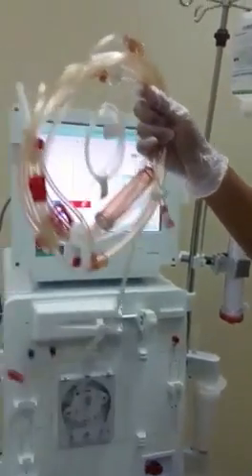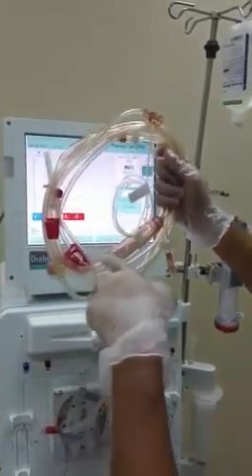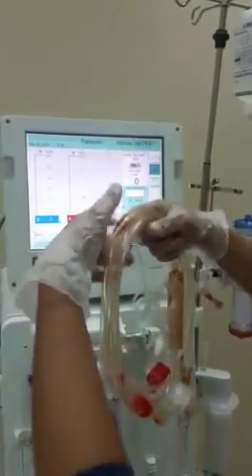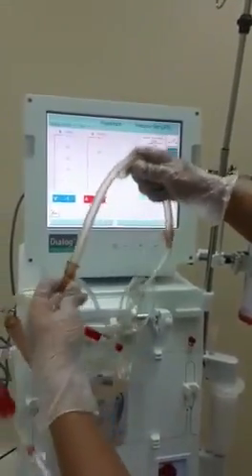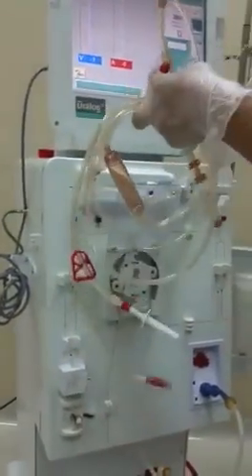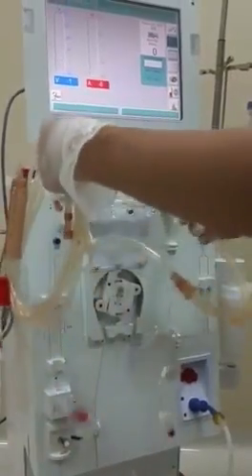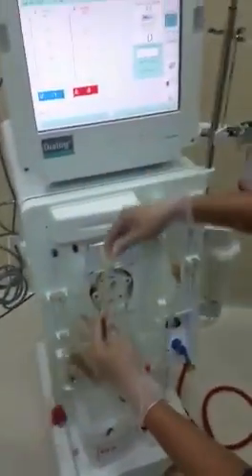First, we will take the arterial bloodline. Note that the arterial bloodline will always be red colored. We will start from the rotor. What I usually call the bigger Y, because of this part, is always on the left.